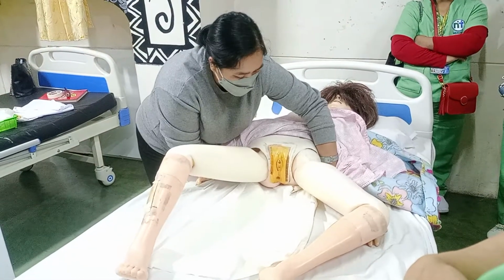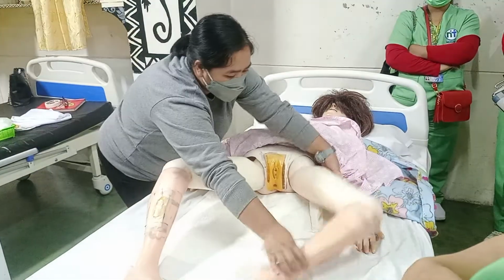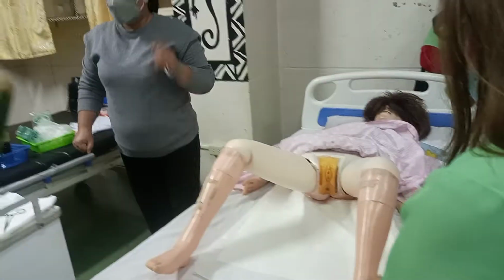Another one, ma'am, please help me. 1, 2, 3. Thank you for the assistance. O, sino ang paa ni Mrs. Smith dyan? Thank you. Next, I am going to put my drape.